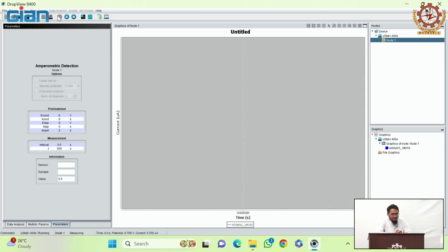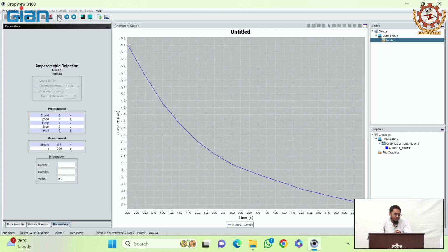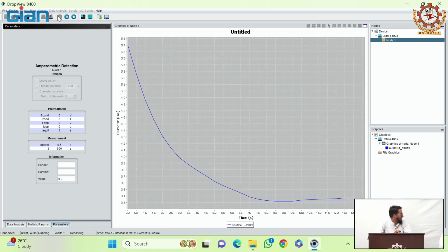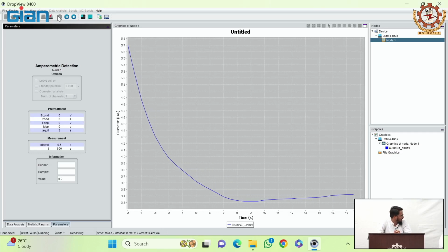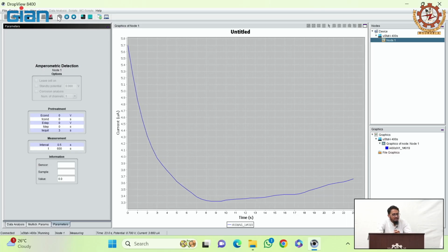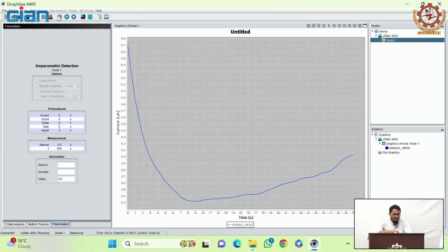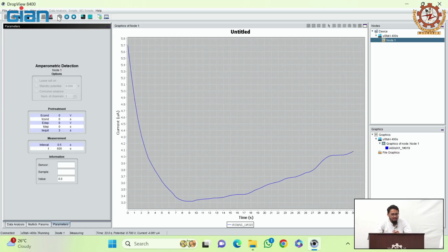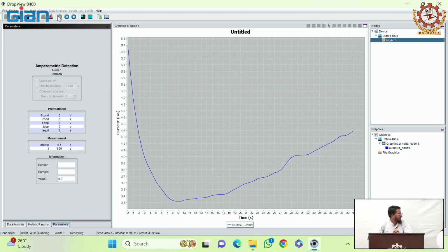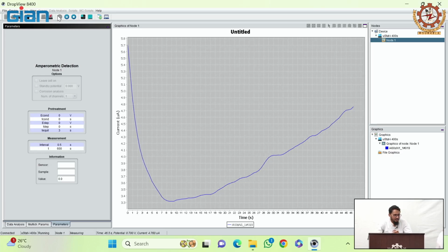So this is amperometry. In amperometry, if you remember from your classes, the potential is fixed. It's not swept. In CV, the potential is changed in a triangular waveform, but here it is fixed, and the current is observed. Ideally this current should stay stable, flat. There might be some disturbances due to recording equipment and noise, but overall, more or less, it will look like an exponentially decaying curve.